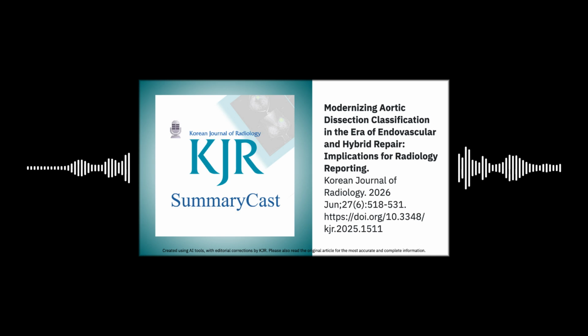Rupture seems straightforward. Is there a hemopericardium, mediastinal hematoma, or hemothorax? Yes, those are the urgent findings. Malperfusion is more nuanced. The report needs to detail which branch vessels are involved, from the coronaries down to the iliacs. And crucially, it's important to describe how they are compromised.